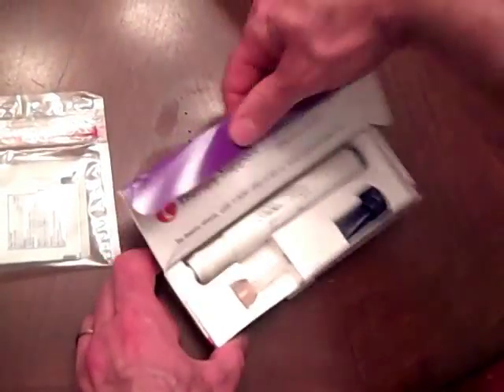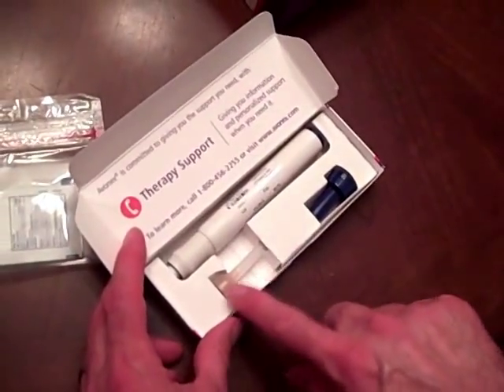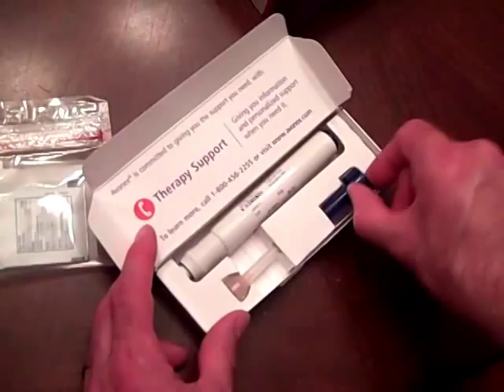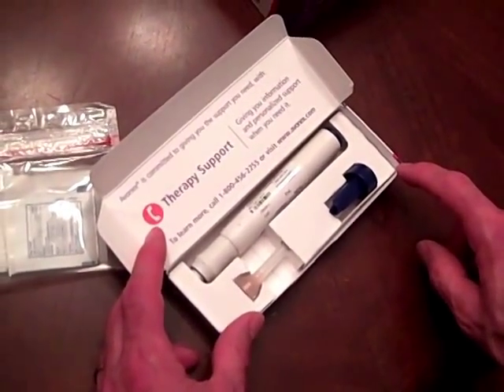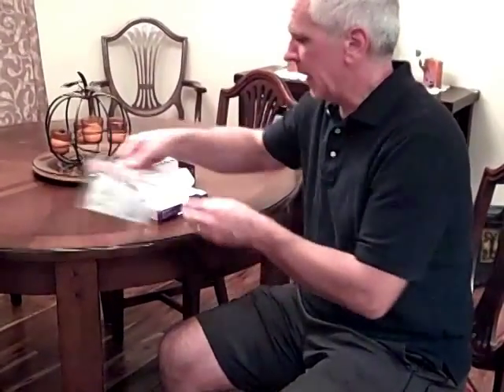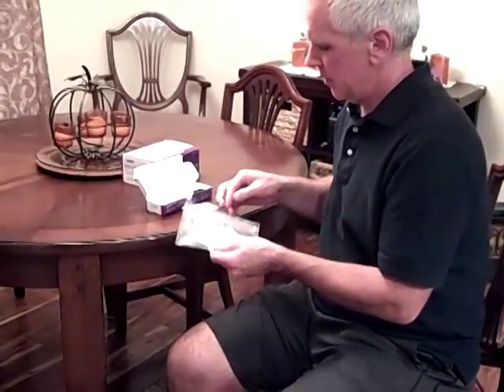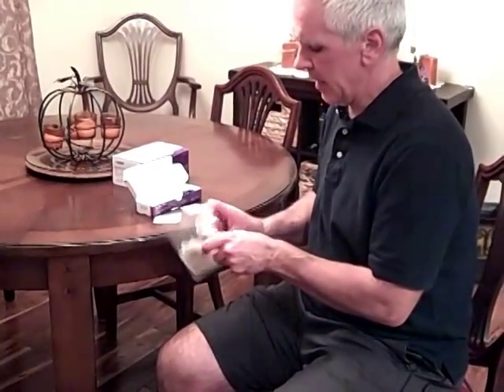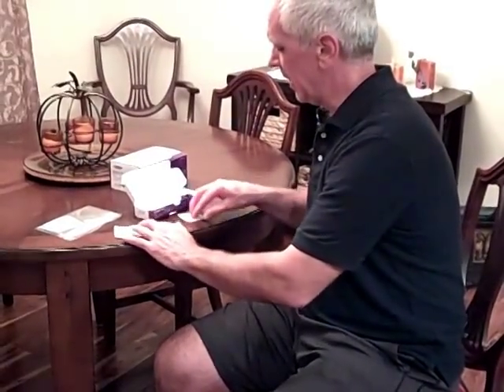When I open it up, inside we'll see the pen right here. Here's the needle that we'll be attaching, and this is a device that you use at the end just to protect yourself from the needle once you're all done. The first thing I do is go ahead and open up an alcohol wipe, get out a gauze pad and a band-aid — those are the three things I might need.